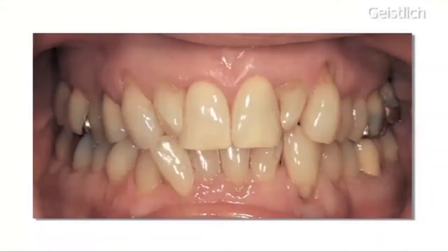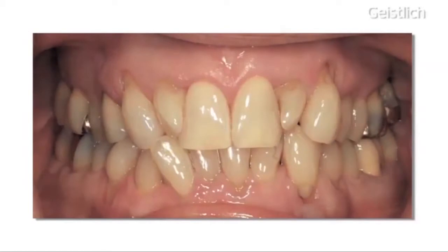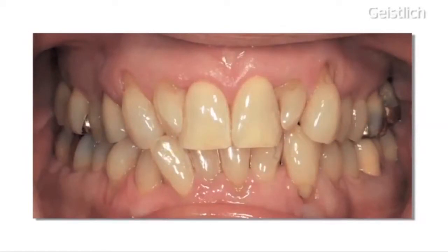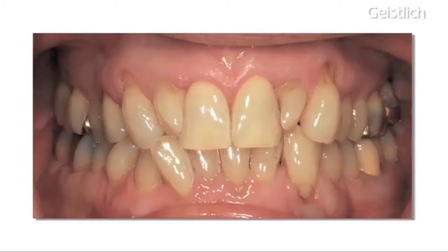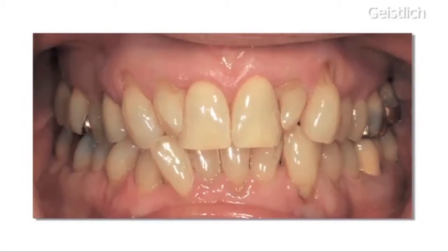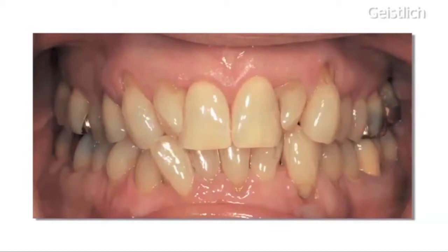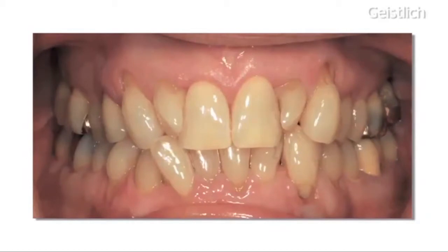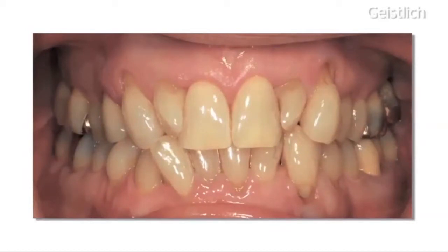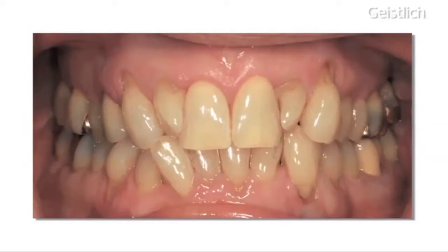This patient is presenting in good general health and is suffering from moderate to advanced periodontitis. Prior to surgery, the patient received a session of prophylaxis including instructions in proper oral hygiene, scaling and professional tooth cleaning.